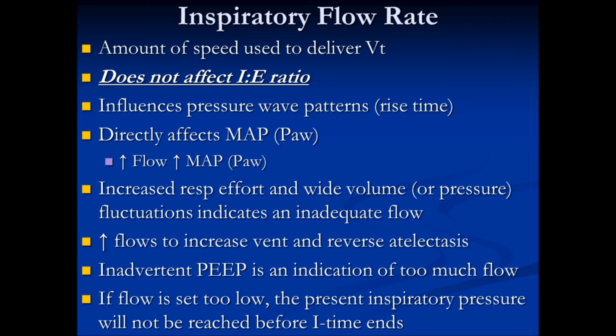It shows how, depending on what your flow is set on, it will determine how that waveform looks. So if you increase the flow, it's going to get to that set pressure faster. If you decrease the flow, that means it's going to spend more time getting to the set pressure. So the waveform is going to have a slanted look.